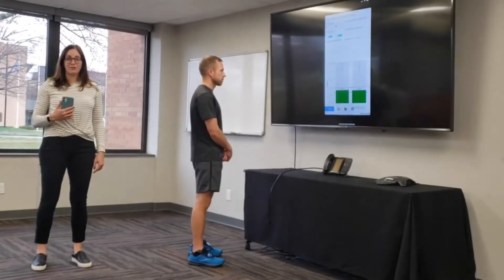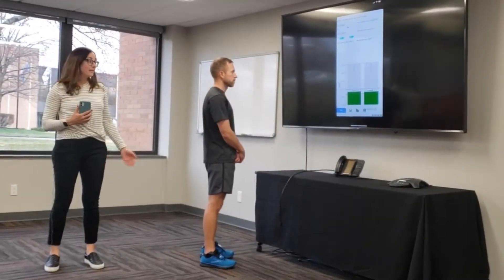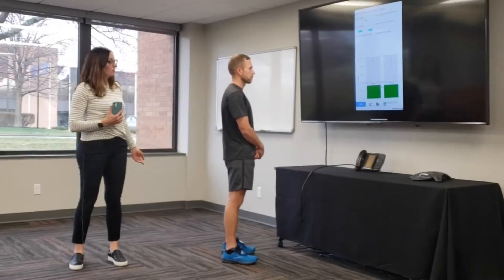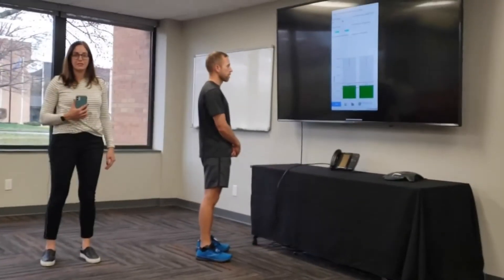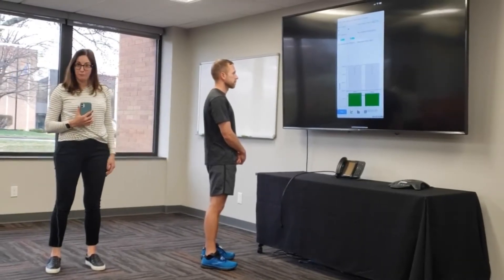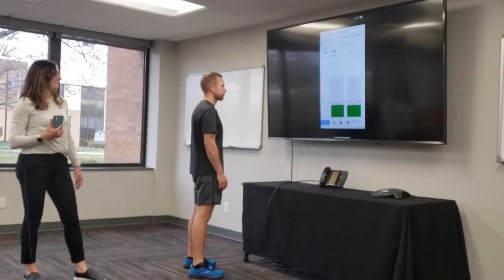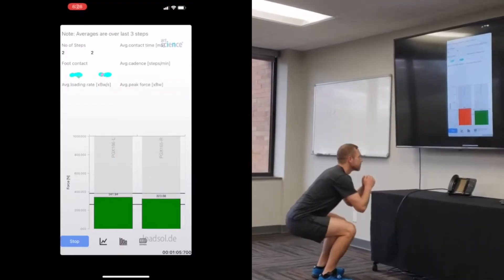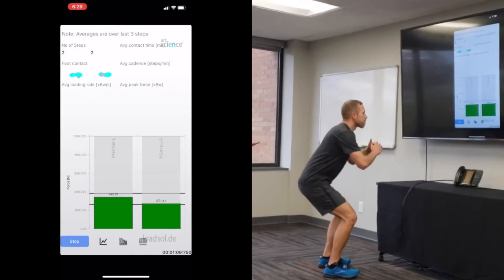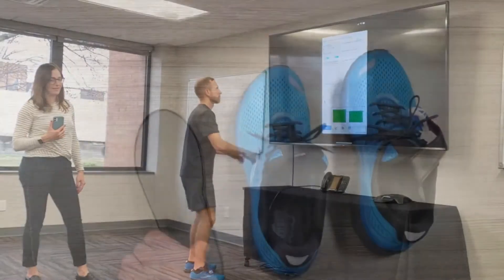We are now going to view the LoadSol in a live data collection mode. Ben is going to perform a squat for us, and he is also viewing a left and right bar graph from each of his feet. We are going to see if he can keep his weight even on both legs. Go ahead and squat for us. As you can see, in this squat, Ben is favoring his left side and offloading his right side.